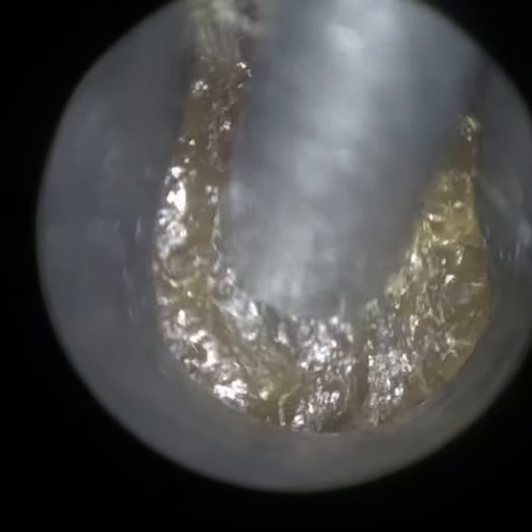The right ear is fully blocked with this very sticky, glutinous wax keratin. The patient has got quite a narrow ear canal.